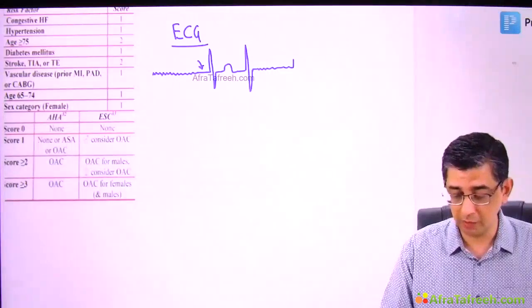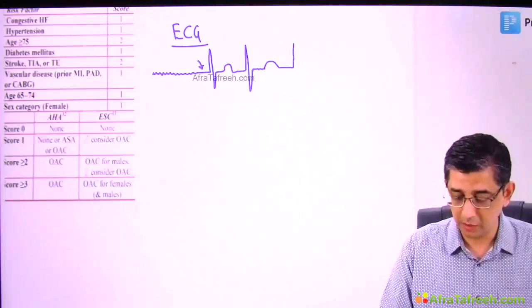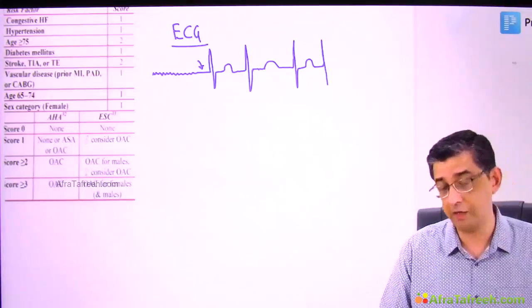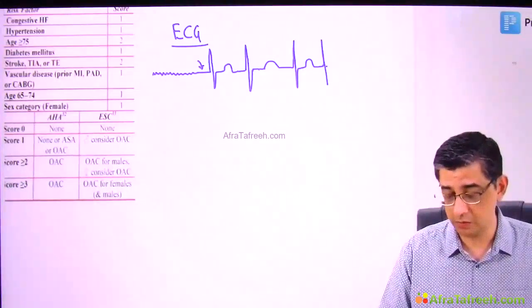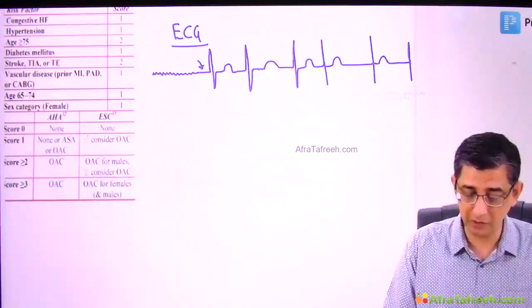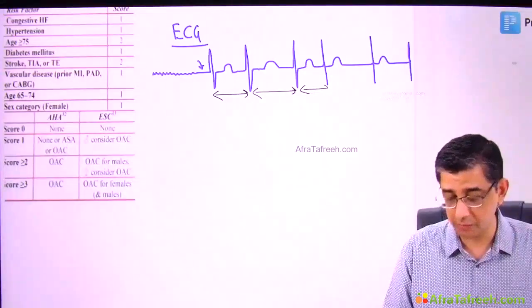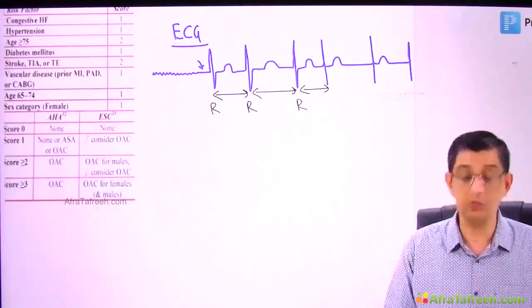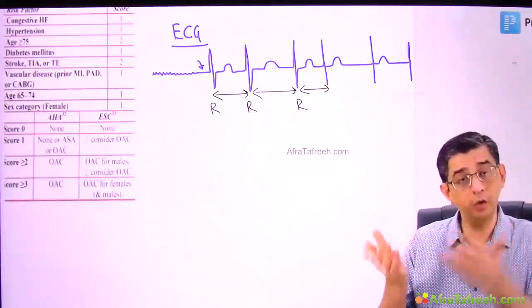And then the next problem that will come up is, again, I'll just highlight the fast beating of the heart and a very characteristic feature that will occur in these patients in the ECG. I highlight once again, the twitching part may not be visualized, but you will still be able to pick up the ECG, which is what I'm trying to represent here. And that part is, guys, that in this particular chart, the RR interval will never be constant. You see, in all tachyarrhythmias, mark my words, in all tachyarrhythmias, the distance between the R and the R wave will always be constant. But in these patients, the RR interval will keep on changing, and in between, heart rate may be normal.